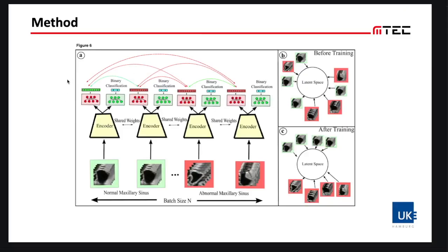Here is an illustration of our approach. With the aforementioned challenges of learning anatomy and anomaly invariant representations, we employ supervised contrastive loss with cross entropy loss as an auxiliary loss function. We do so by having contrastive heads and classification heads, respectively. The red dashed lines here represent features being pushed apart from one another, and the green dashed lines here represent features that are pulled towards one another.